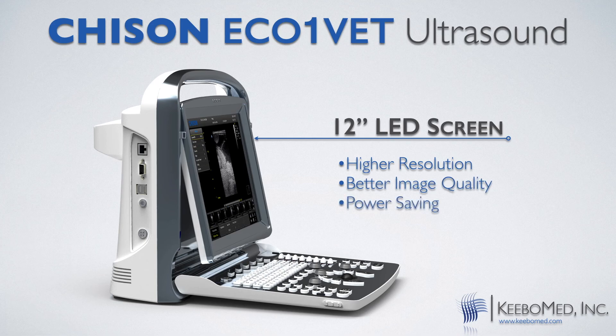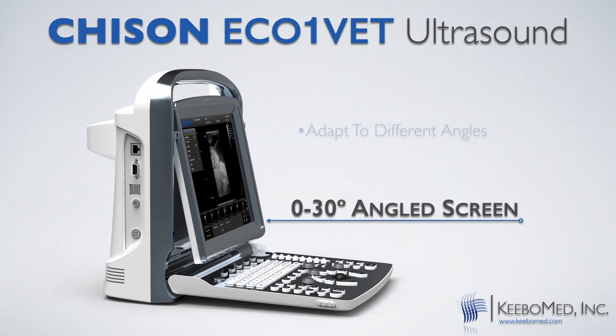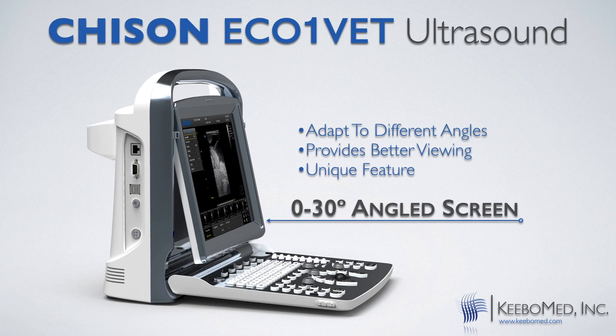The Eco has good image quality but at the same time is easy to carry, making it great to use in outdoor environments. The screen also tilts, which makes it easier to look at from different angles.